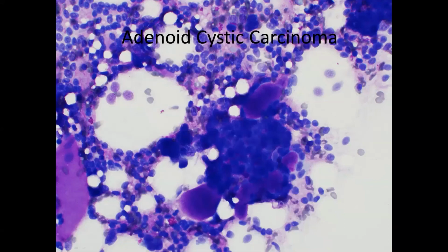And so, these features are in stark contrast to what you see in an adenoid cystic carcinoma. Again, you want to look at the cells, the relationship of the cells to the stroma, and also the character of the stroma. So in a pleomorphic adenoma, we had two different cell types, we had very fibrillary stroma, and we had the myoepithelial cells percolating through the stroma. Keep those things in mind as we discuss adenoid cystic carcinoma.